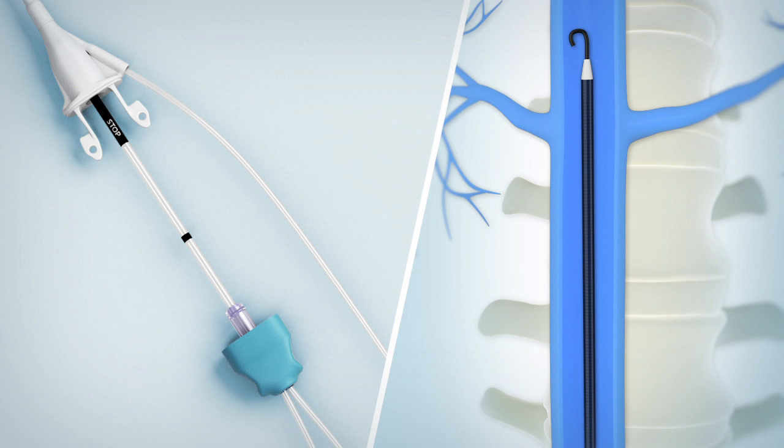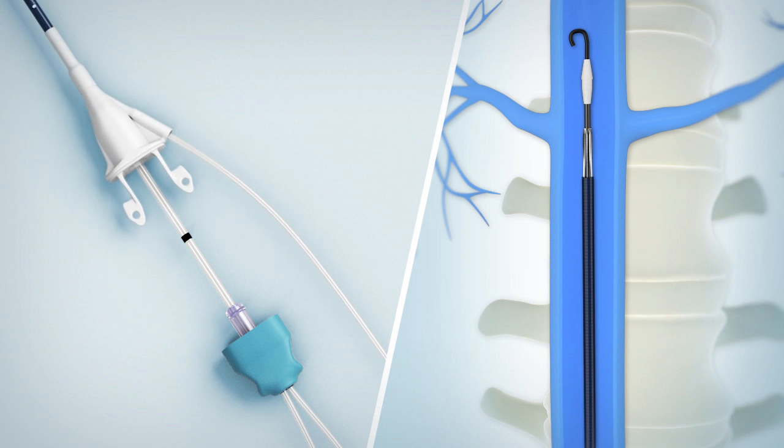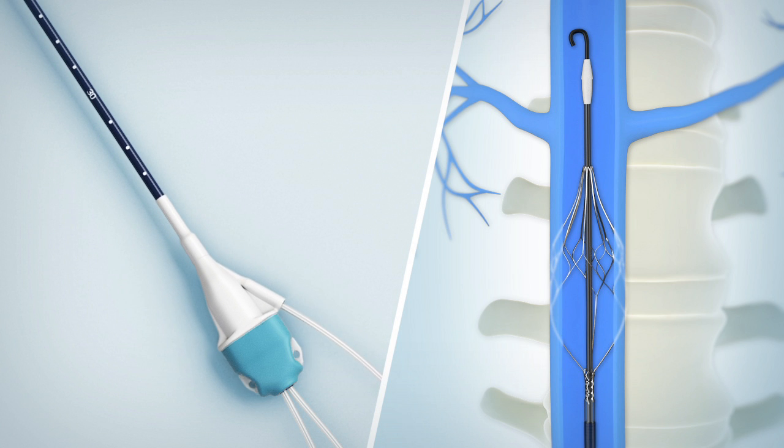Hold the teal hub stationary in one hand and retract the white hub with the other hand to deploy the filter, ensuring that the hub is securely locked together.